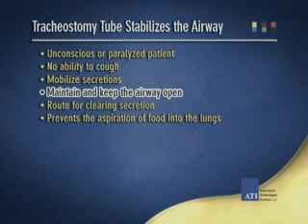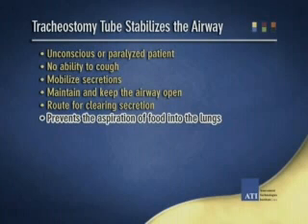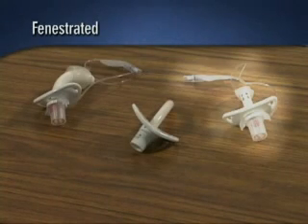Additionally, the tracheostomy offers the client a route for clearing secretions as well as prevents the aspiration of food into the lungs. A client would have one of three basic types of tracheostomy: cuffed, uncuffed, or fenestrated. The fenestrated type allows limited speech as air passes through the upper airway when the cuff is deflated and the external opening is capped. Whichever type of tube is in place, the goal of tracheostomy care is to prevent infection and skin breakdown at the site and maintain a clean, dry, stable airway.